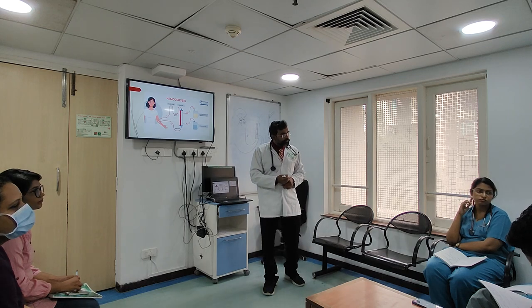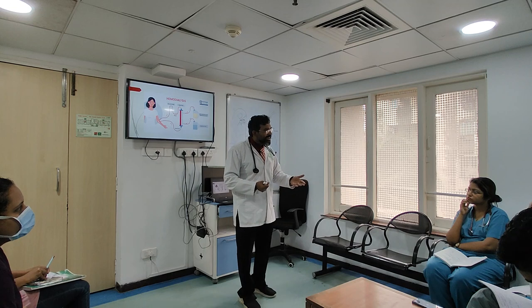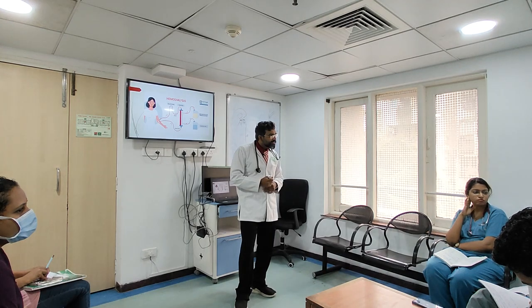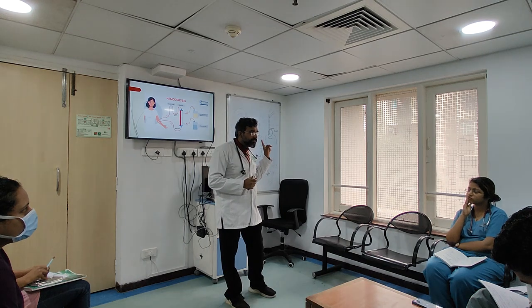So even a left-sided jugular, no, it should not be. That is what I'm trying to tell you. That's why every time I come and say, "Hey, left jugular rakha hua," I ask this question, right? Why do you ask this question? No, I mean, HD on the right side, and then we shift to the left side. So HD is different. We are talking of CRRT.